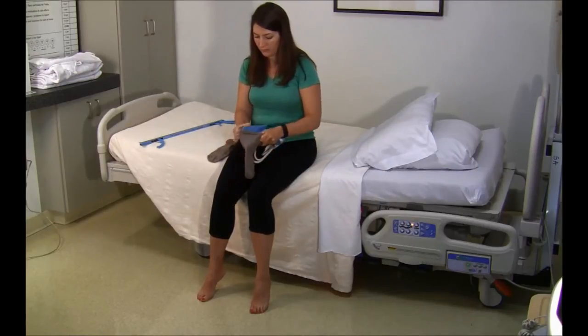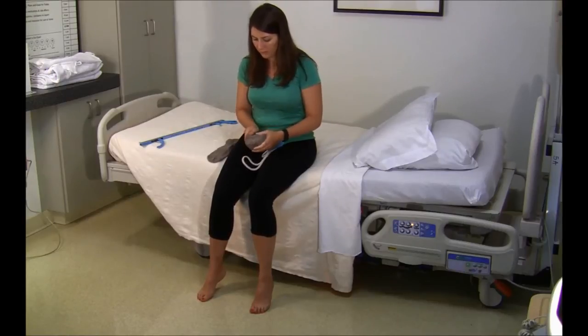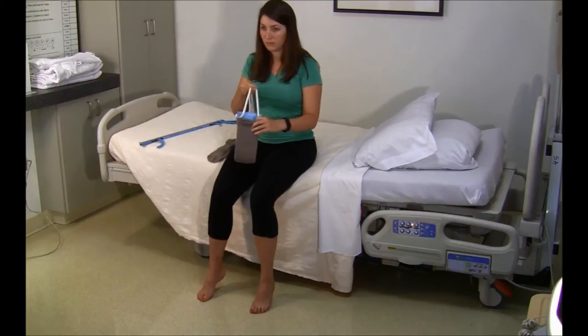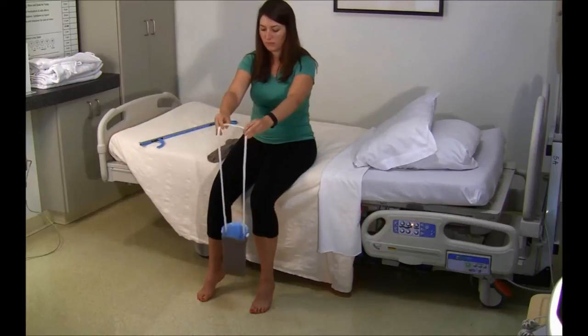The heel goes at the bottom of the stocking aid. Get as much of the sock onto it as possible, up until the knots on either side. Once the sock is loaded onto the stocking aid, hold onto the string and drop it to the ground.